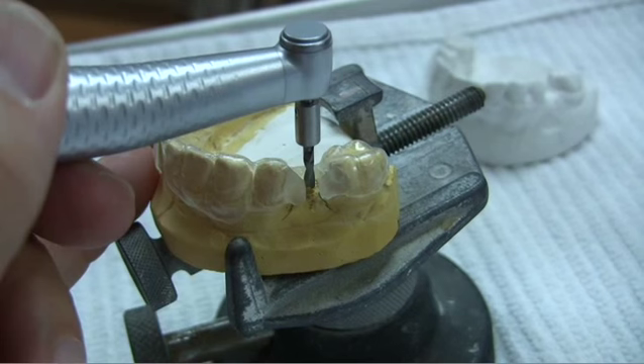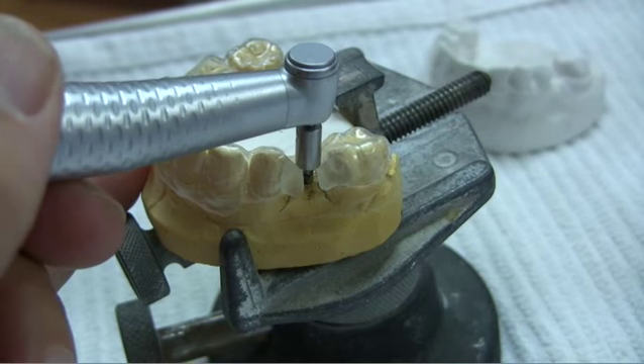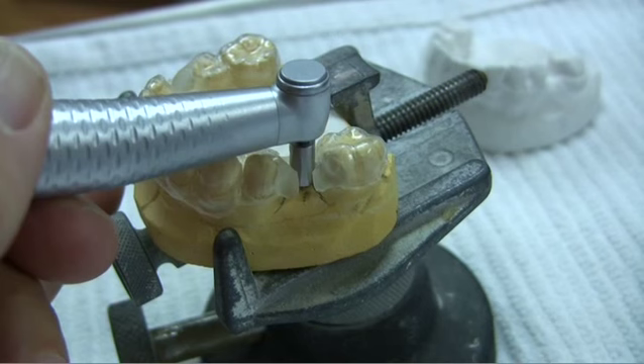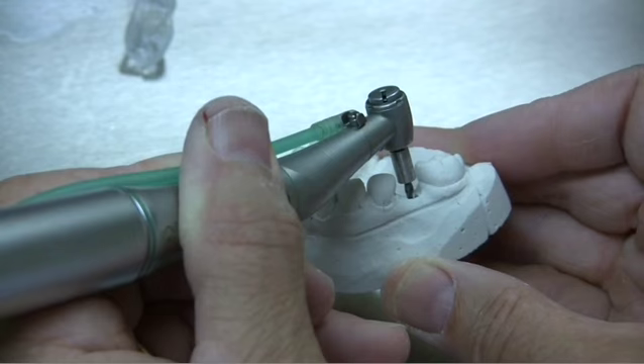First, the 2.2, followed by the 2.8 and 3.5 millimeter drills. The stops and guide will control the axis as you enlarge the osteotomy. As you can see, the stop will limit the vertical drilling depth and the guide will control the axis of your drilling. The stops may also be used without a guide, and there is no need to strain to see the markings on the drills.